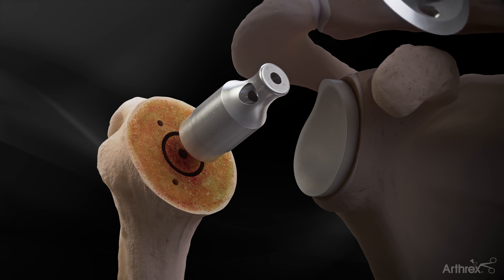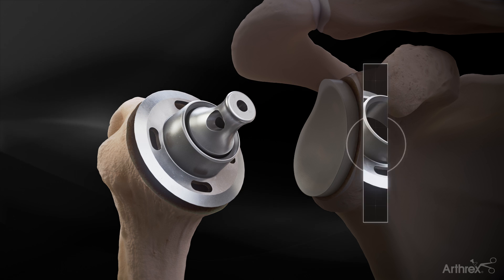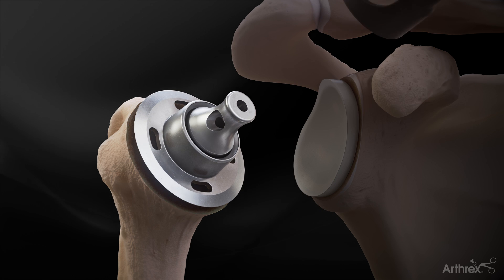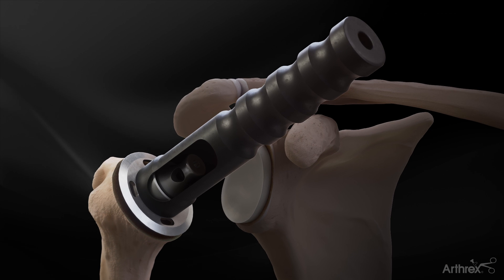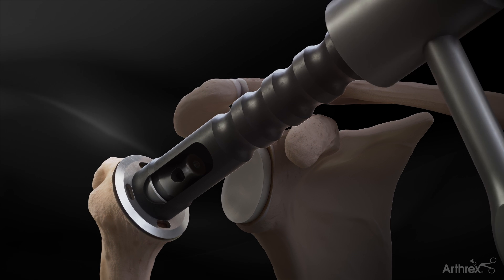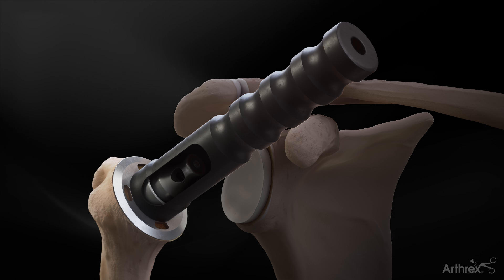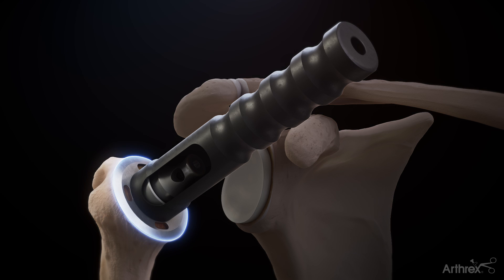Return the centering device in place on the humerus. The trunnion is placed over the centering device, and the trunnion impactor and mallet are used to seat the implant into the humeral metaphysis. The trunnion should have circumferential contact with the cortical rim without any overhang.